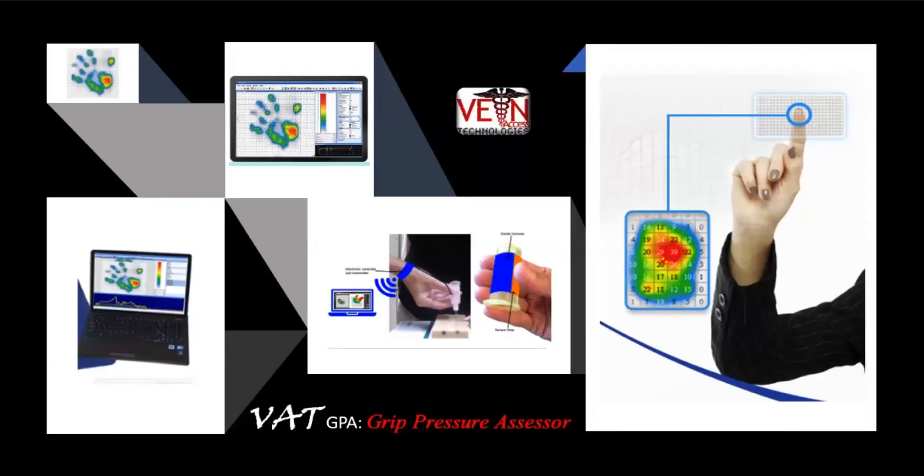This new tool is called the Grip Pressure Assessor. It's going to tell us about how much pressure is being applied to that needle system upon needle insertion, and we can really improve any needle insertion by determining this information.